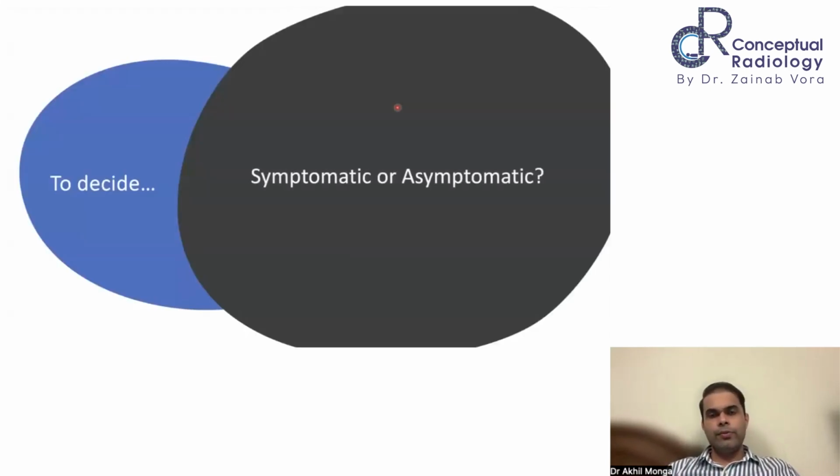So the first thing that we have to question is whether it's a symptomatic stenosis or an asymptomatic stenosis. So say I got some Doppler done. Somebody felt that it might be needed, say a CABG patient planned, just getting a Doppler done of the carotids. Risk factors are there. Patient undergoes a Doppler for carotid, a neck ultrasound, and finds out that there is carotid stenosis. So those are considered asymptomatically found. Got a CT done and got detected for carotid stenosis. CT was done for something else. So that is the asymptomatic part.